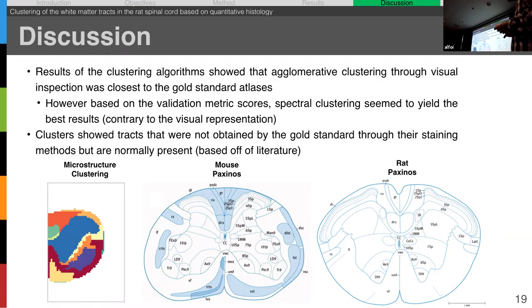I think the segmentation is the longest part of this. I don't remember the exact time. The rest isn't as long. The template generation takes a few hours as well. So I'd say half a day is a reasonable estimate. The clustering doesn't take as long; it doesn't run too slowly, so it's inherently quick. But it's the processing of the images that takes the longest part. So about half a day for one slice.